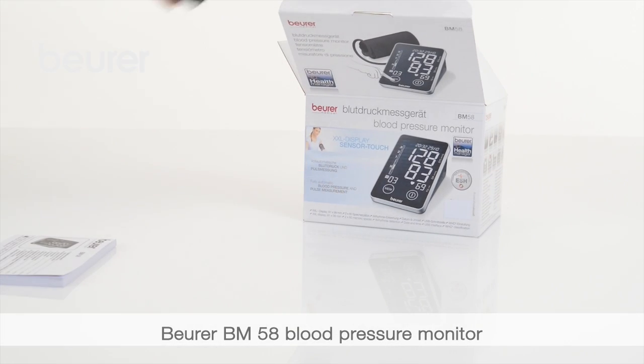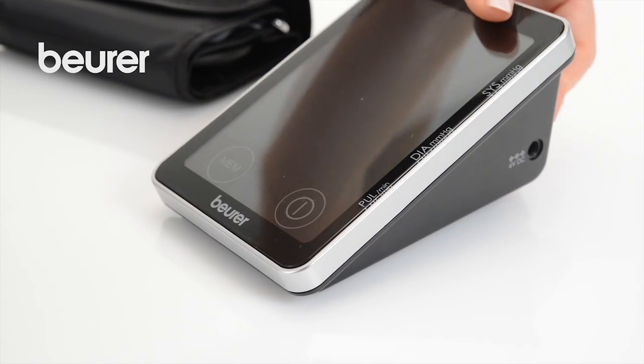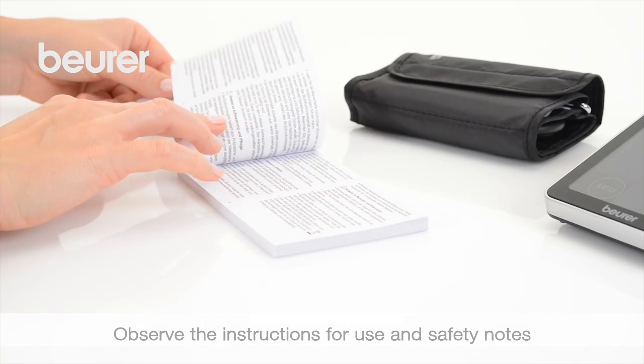Here are some tips for using your BM58 blood pressure monitor from Beurer. Pay attention to the instructions for use and safety notes.